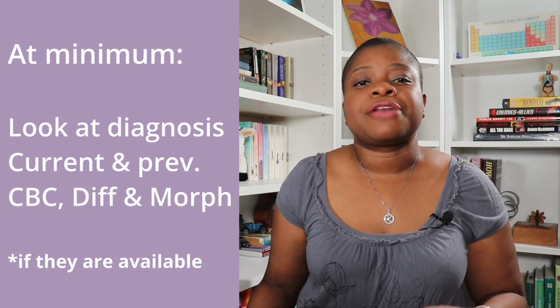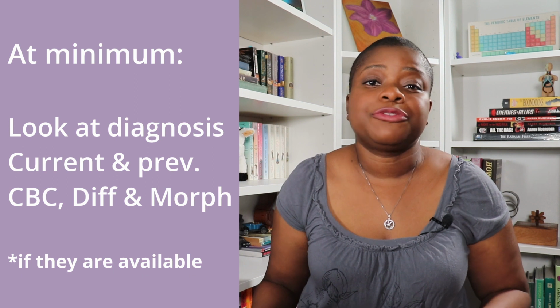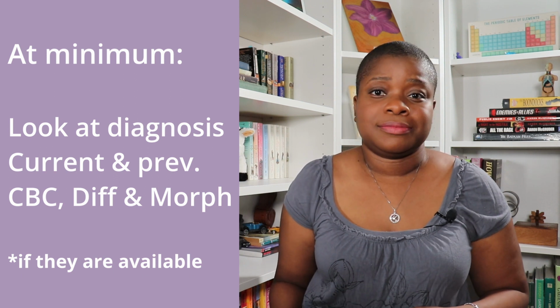I know you're saying, that's a lot of things to be looking at for every patient, every time. It is, and I'm not expecting you to do such a thorough analysis for every patient. What I am saying though is at minimum, you should be looking at their diagnosis and their current and previous CBC, differential, and morphology results. And that during certain situations, it may benefit the patient for you to take a deeper look into their history.